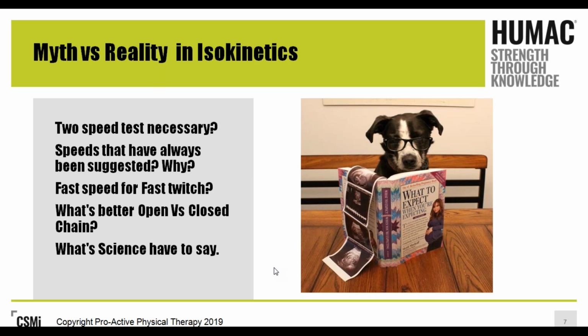Well, while you were able to train a little bit from that standpoint, without doing eccentrics, you were losing more than 60% of what we do functionally. So, we have to kind of pay attention to that. And speeds are going to be something that we're really going to be big on tonight.